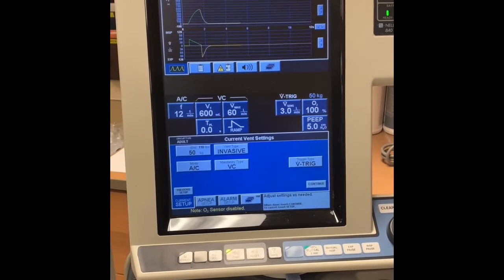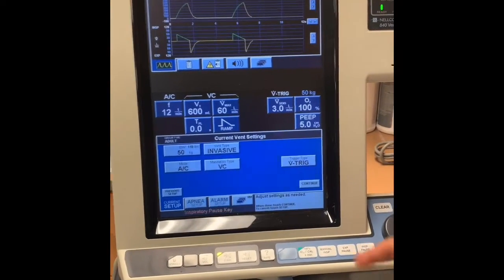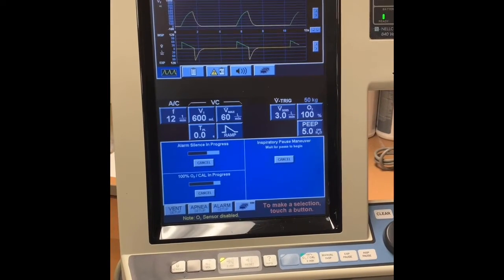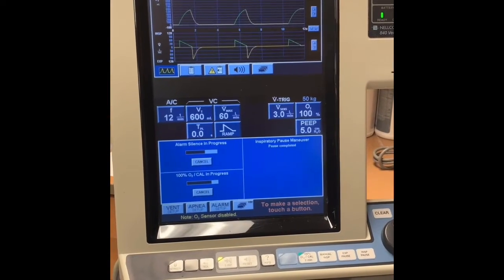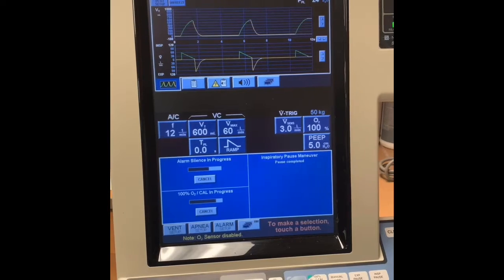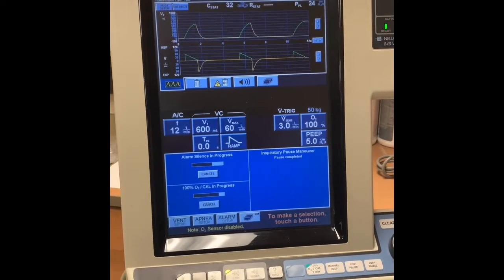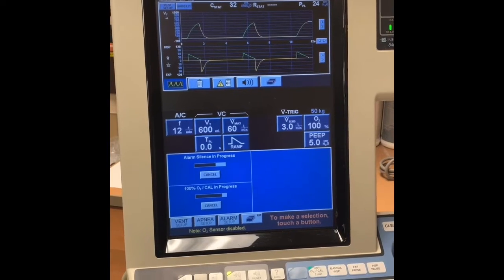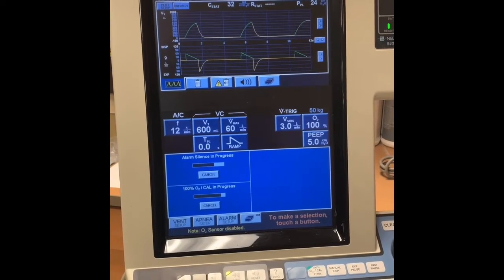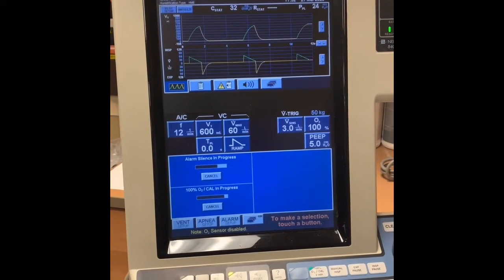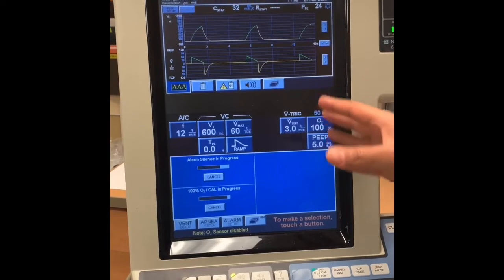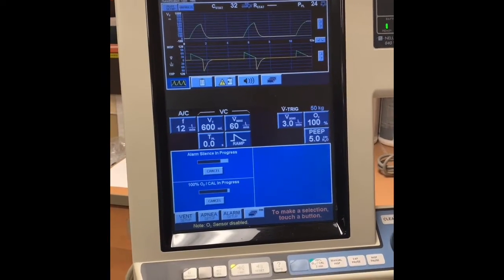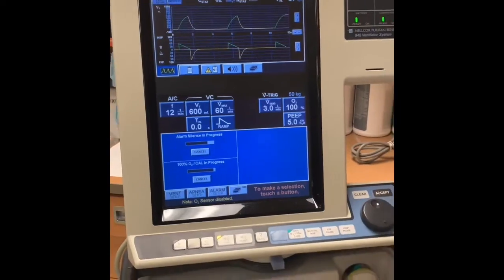For high PEEP, I like to do a plateau pressure. I'll get a plateau pressure and that will give me a good indication on where to start, plus or minus 2. You can always start lower. Sometimes if you can't get a plateau pressure, I go peak plus or minus 2.